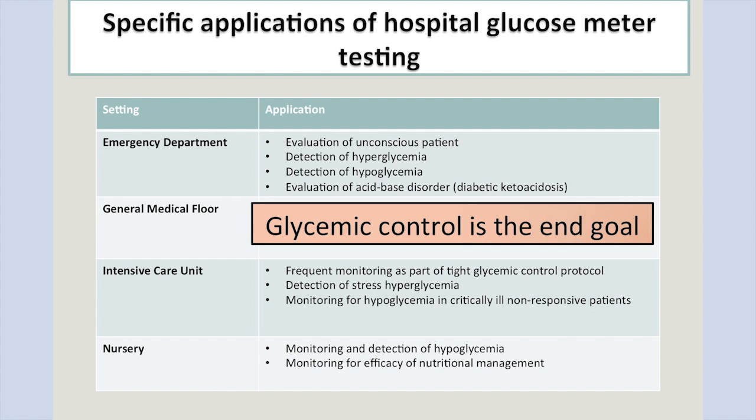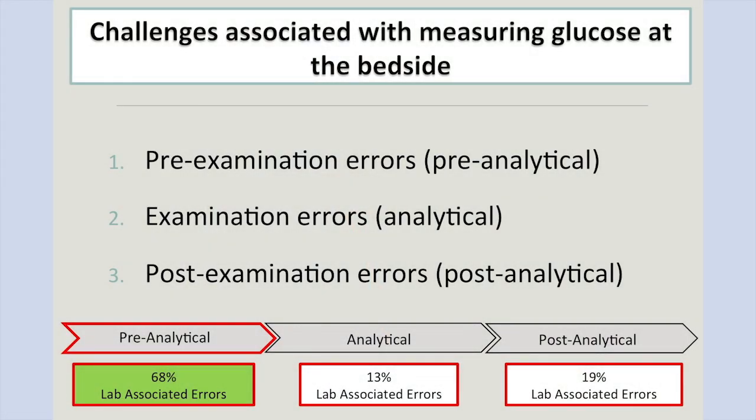So ultimately, what we're looking at is we want glycemic control. Whatever it is, we want glycemic control. As we know as laboratorians, we have challenges. It doesn't matter what test you're offering, we will have error. And our error, as Nam had pointed out, we've got bias and imprecision errors. And there's errors in everything.